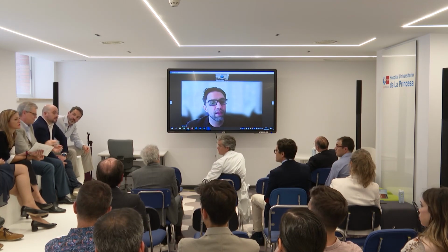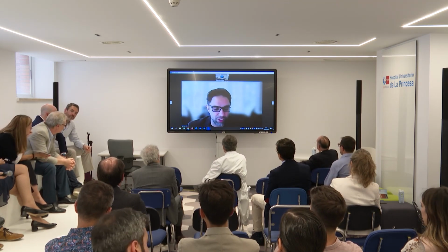About nodule morphology, if there are any predictors of success. Great question. So as you know, there are two types of nodules: eruptive calcified nodules, which are biologically active, which are like broken glass. Those are not effective using any strategy. And the reason is the broken glass usually happens at a hinge point. And then when you put a stent on it with 18% surface area coverage, the spicules of that broken glass just poke back into the artery. We just published that 2 weeks ago in JACC Interventions: a 20% event rate at 2 years in patients with an eruptive nodule.